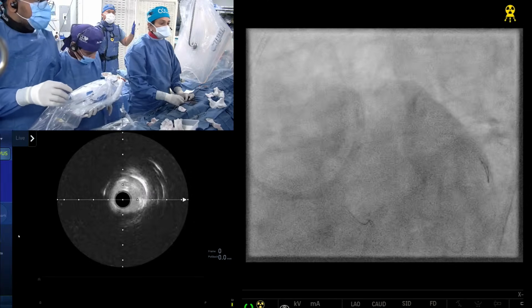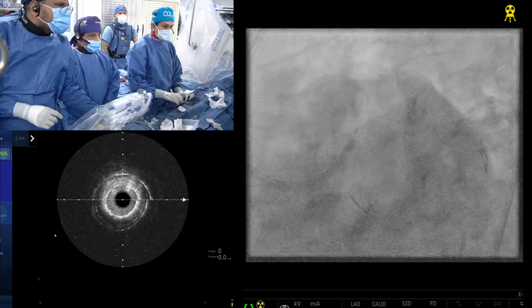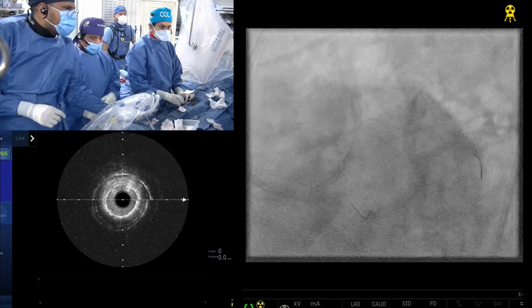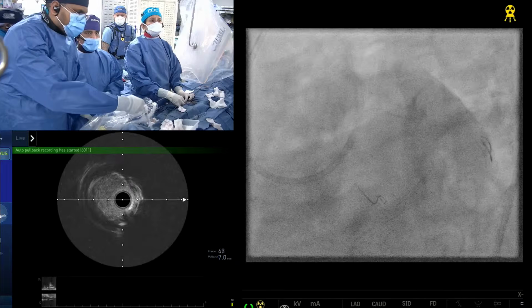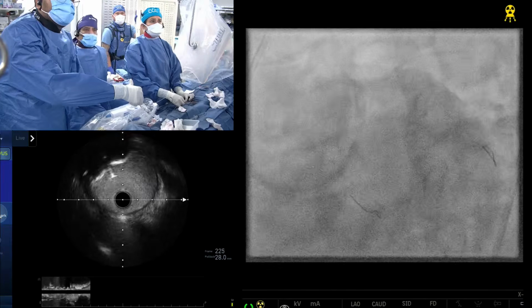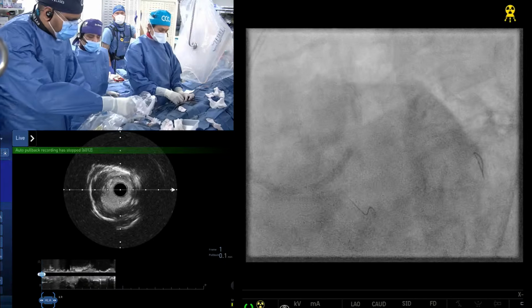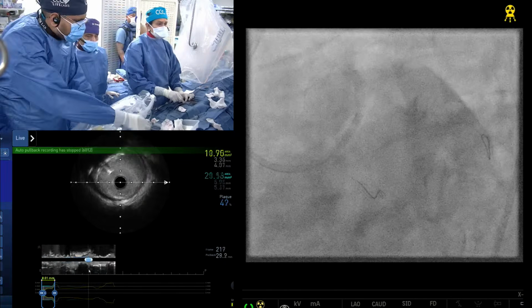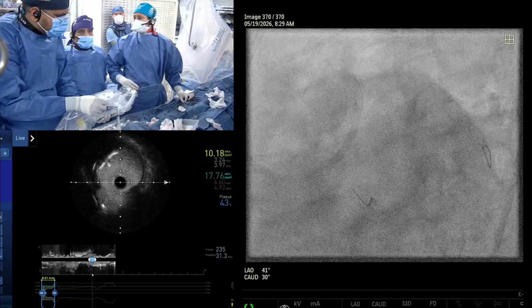Okay, I'm going to the ostial circumflex. Sure. How was your experience doing so many cases with that? How does it compare with the existing IVL? I think it is more flexible, and secondly, the setup is very clear. You don't have to get those extra covers and so on. Basically you just connect it. All these companies are working on that. Each cycle is less than 10 seconds, so that causes less ischemia. Even our current Shockwave is coming with 5-second runs.